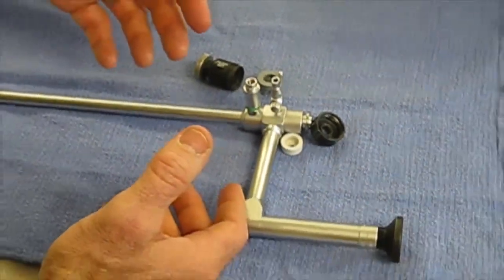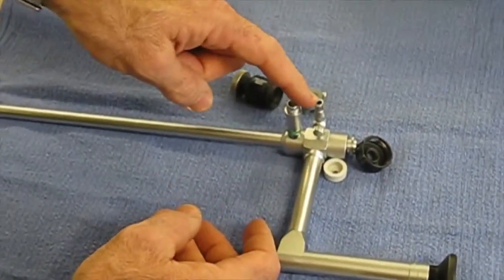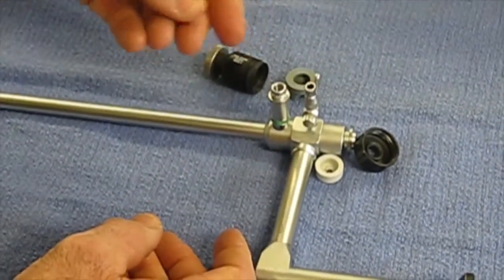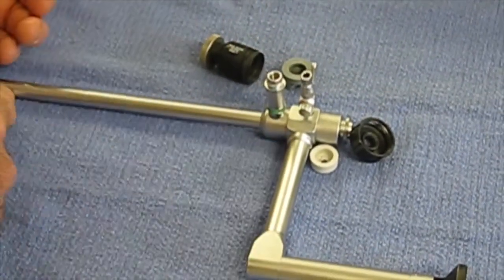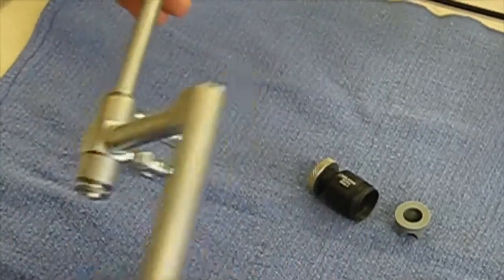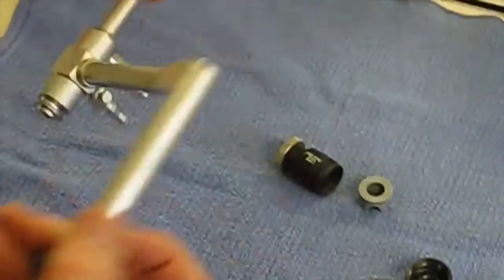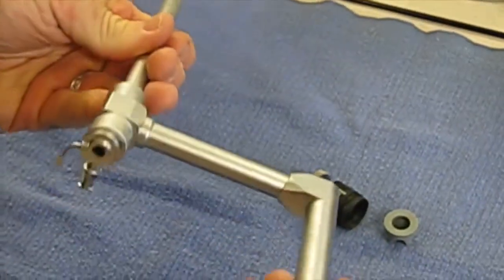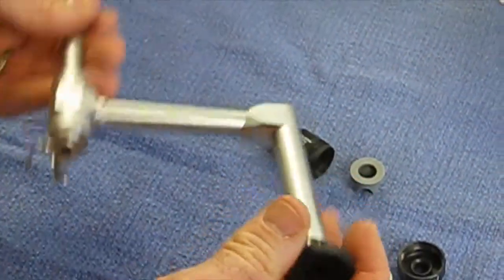Then usually what I will do is I will also hook up a syringe full of air just to blow out any excess moisture that might be inside the channel of the scope. The lenses you want to be careful with and only use a cotton tip applicator, both on the eyepiece as well as on the distal end of the scope, or you can use gauze, which is also safe to use.